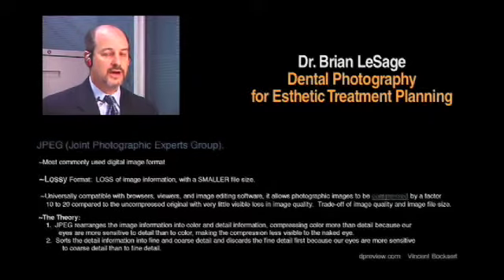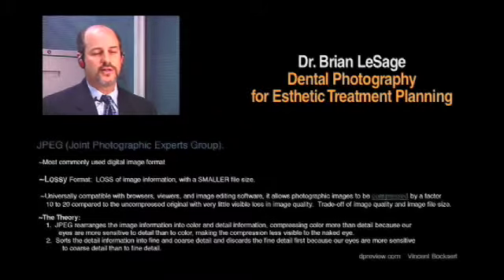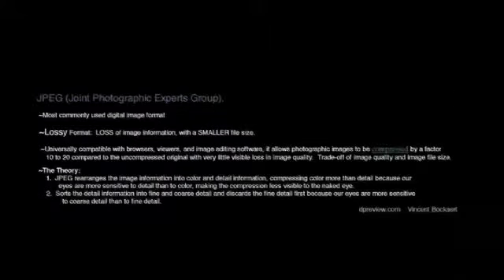There used to be a lot of controversy between CCD and CMOS. Almost like the occlusion wars out there. But pretty much today, most people agree that the CMOS sensor is just as good as the CCD sensor. Most people would agree that probably wasn't the case not that long ago. But certainly today, I think most people agree the CCD and the CMOS are all the same.